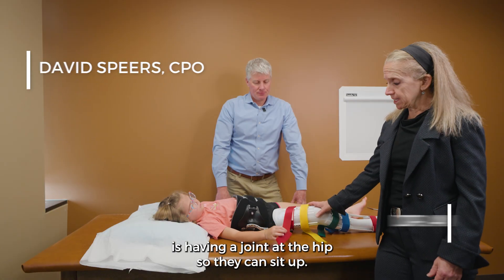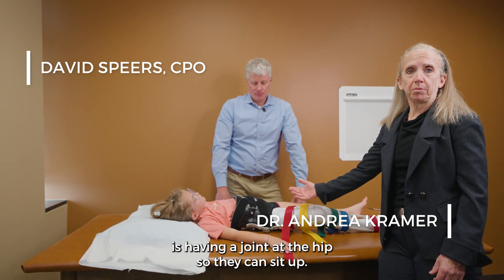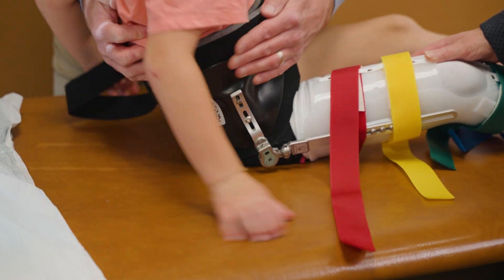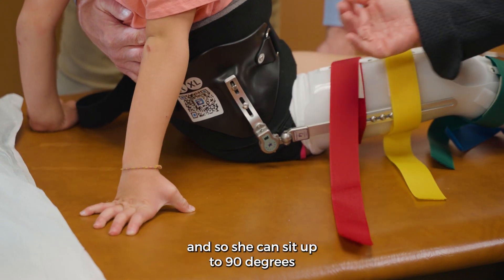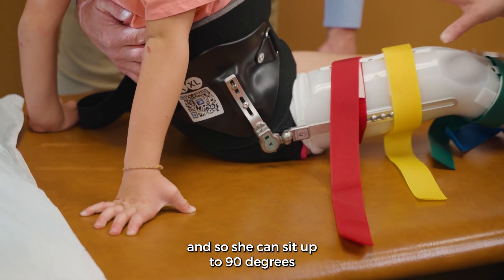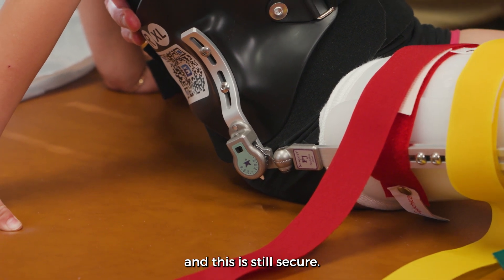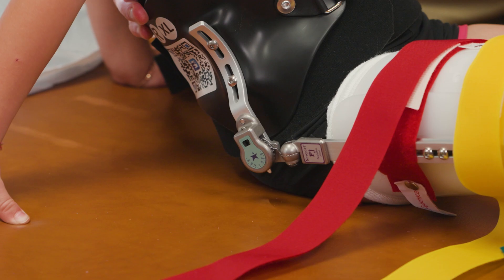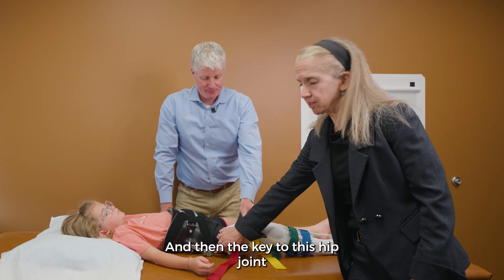One of the advantages to the brace is having a joint at the hip so they can sit upright. That joint is free so she can sit up to 90 degrees and this is still secure. This makes a big difference in activities of daily living, and then the key to this hip joint for all of us is being able to make adjustments.